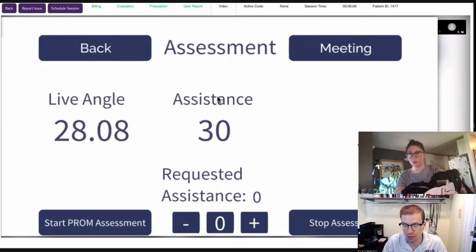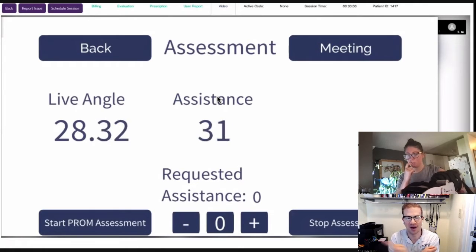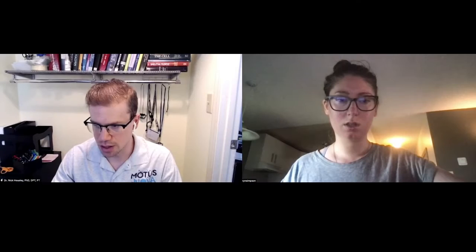I think this is actually quite helpful for us to do this, because this way you're understanding that you can move. You do have the ability to move in both directions. It's just your normal intent is, whenever you say, I'm gonna move down, you're actually gonna move up, and when I'm gonna move up, I'm gonna move down. But let's look quickly at the data and see where we're operating right now.